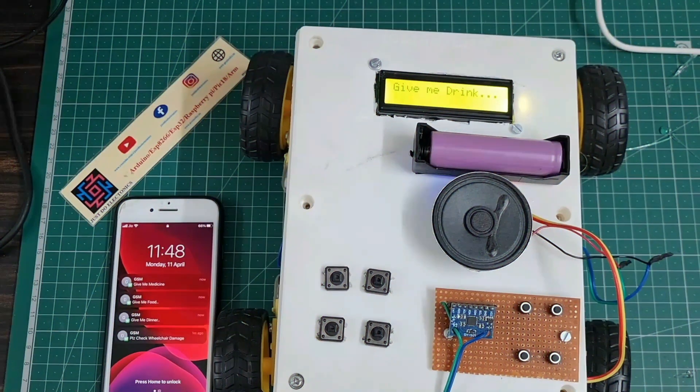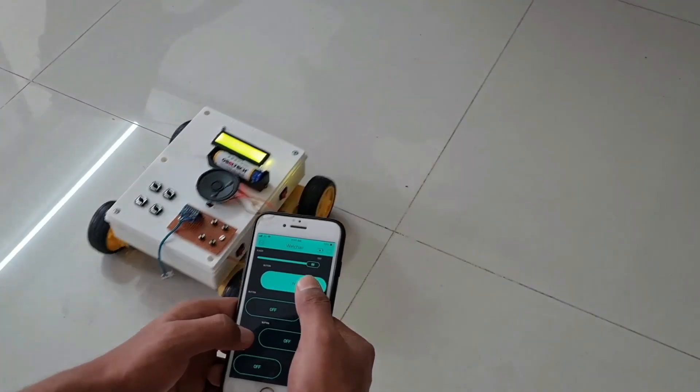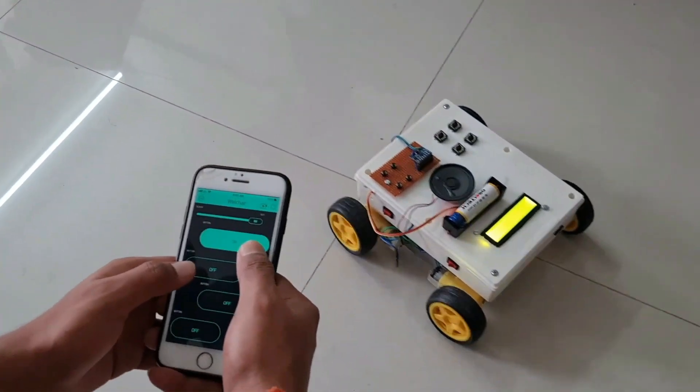In this video, I'll show you this automatic wheelchair with the help of the Blynk app and DF Mini Player. When I press the forward button to start, it will run this project.